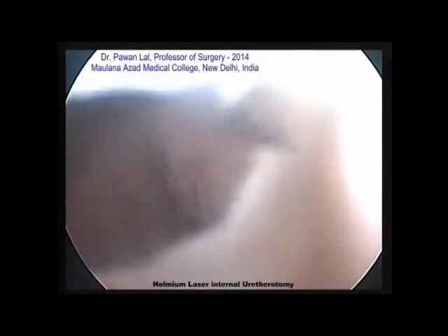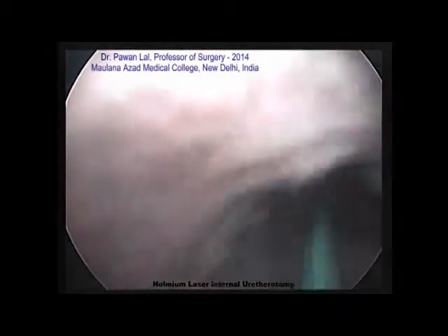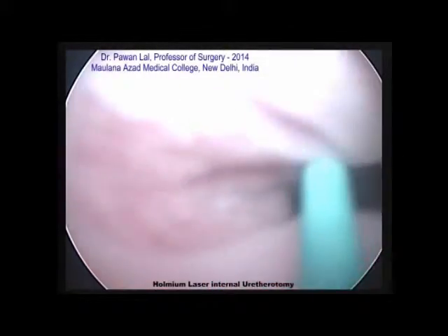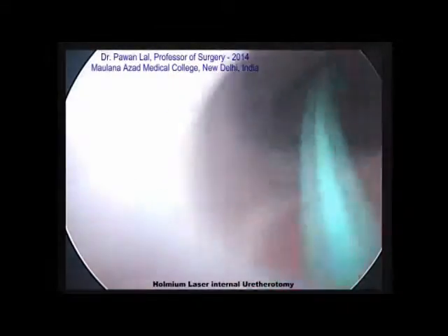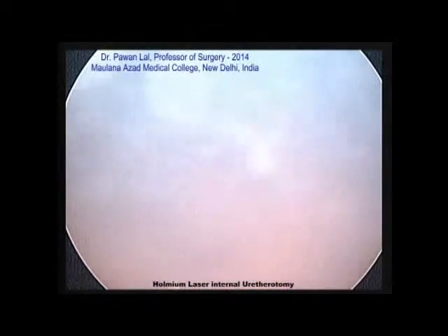After we have done the opening up of the stricture, we negotiate the scope further into the urethra. The guidewire also helps us during this part. There we have reached the prostate and into the bladder.